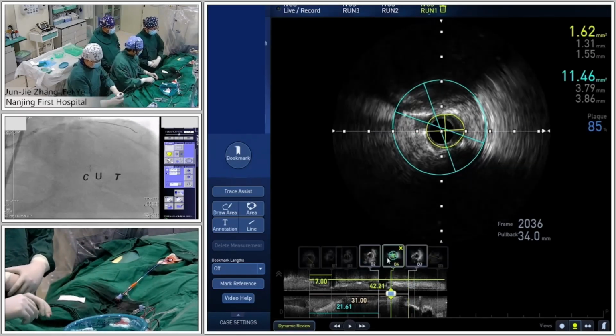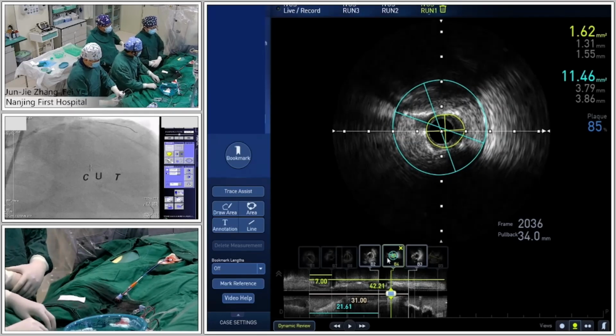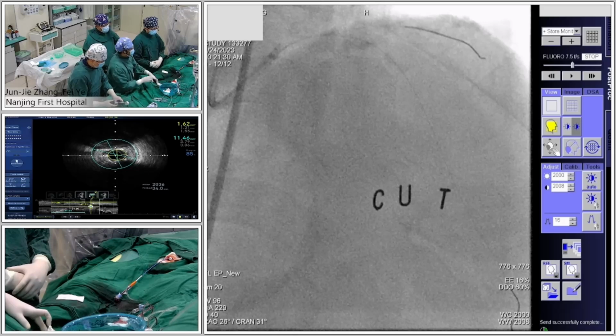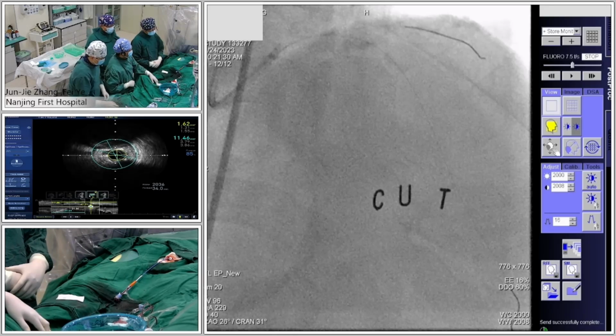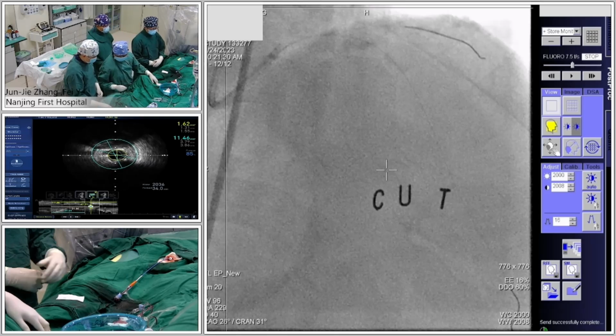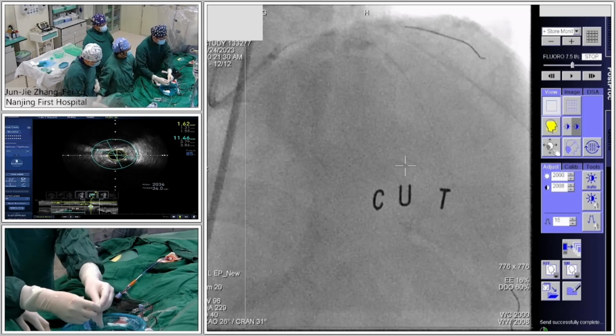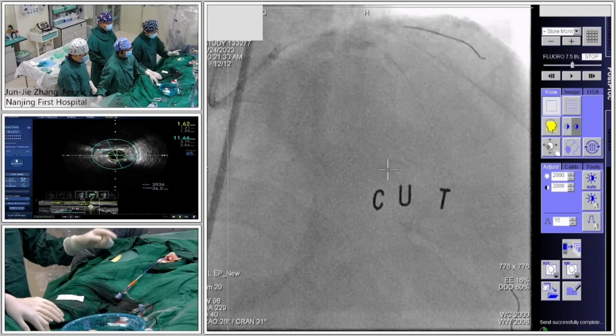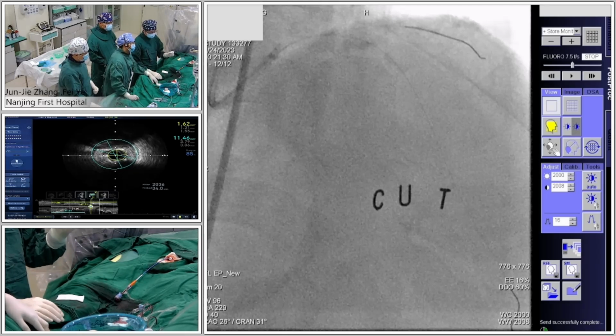Actually, it's not so thick. From the IVUS, you can see although it's a 270-degree arc, it's actually very, very thin. And also at 9 o'clock, there is a crack after 2 balloon predilation. Yes. So, Dr. Ye, thank you very much. And I think lesion preparation before stenting is very important for this kind of situation. Prepare with a large balloon, not a very small balloon.